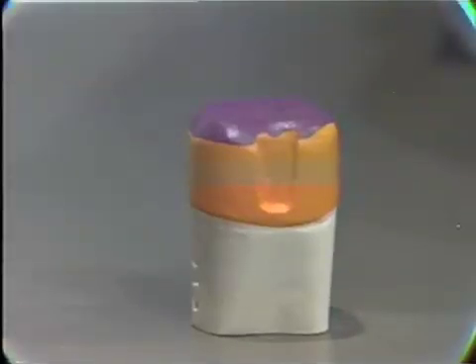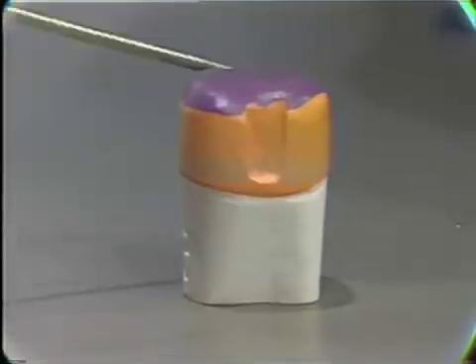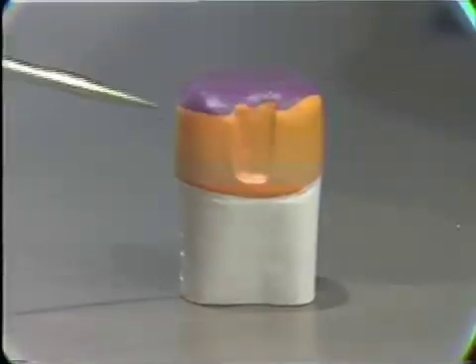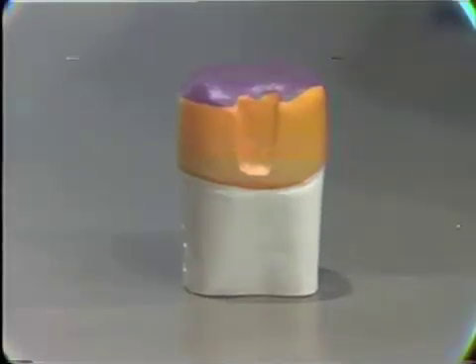Where this may have perhaps excess taper, which it doesn't in this one, or where the clinical crown is very short, as is sometimes the case in a mandibular molar tooth, additional retention can be obtained by placing boxes or grooves on the proximal surfaces, on the buccal or lingual, or on the mesial or distal, or in all of these situations. These create internally the near parallel walls which may be missing on the axial surfaces of the preparation itself. So the cast crown, then, a sort of non-aesthetic complete crown used in posterior teeth, is another retainer which gives maximum retention as a bridge retainer.